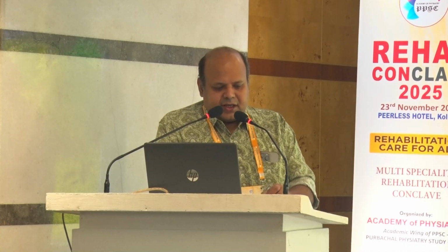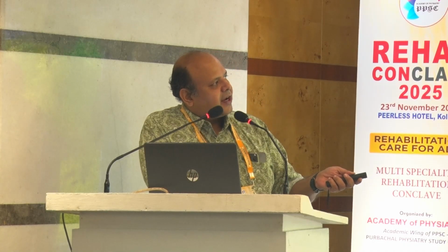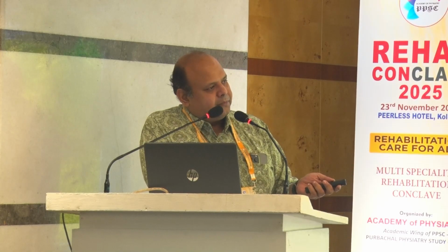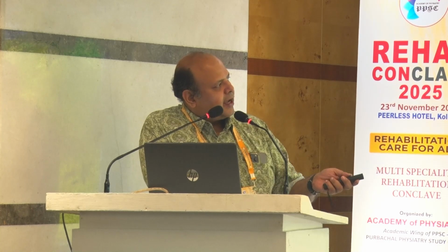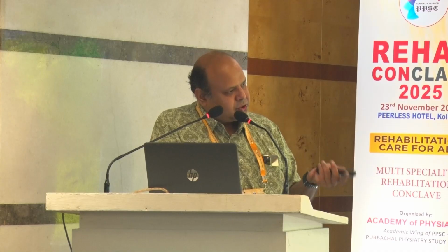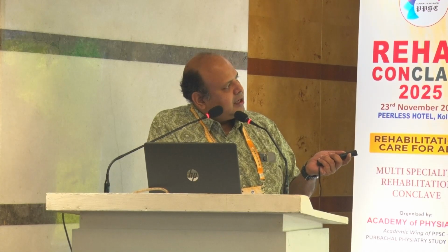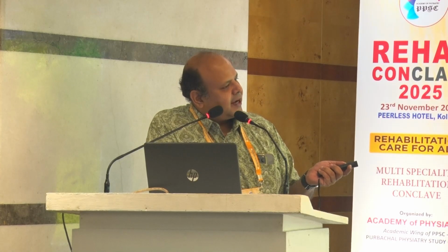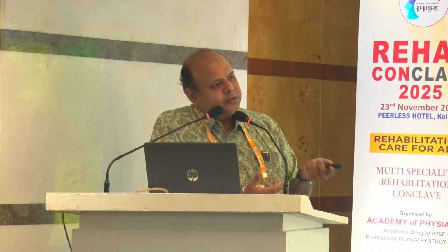You have to see the superficial layer. This part is the subcutaneous fat. This must not have any indentation from your probe. If it does, the edge of the probe shows a black echo drop. If you get that, you are compressing too hard, so release it. If there is an echo, that is bright spots lying in between this fat and your transducer, that means you are compressing too lightly, too superficial.